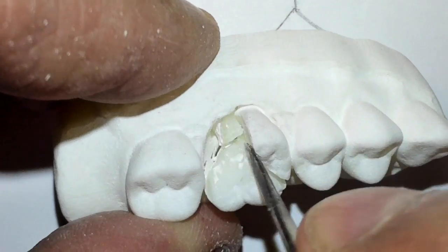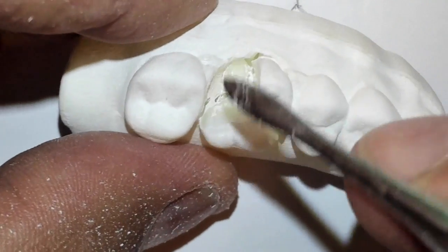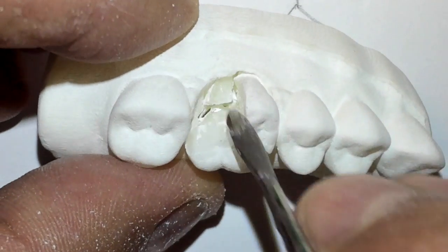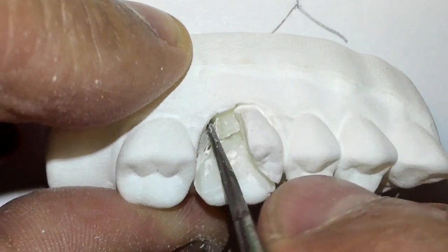You might have to take something called the root tip instrument. We don't want you tapping it out — of course not. We want to create a little more space and maybe you can elevate it out. Elevation is a process where you take an instrument and use it as a lever. It might just come out — you know it's loose.